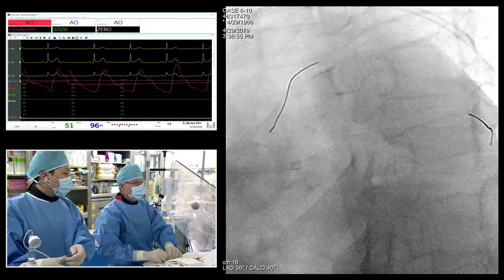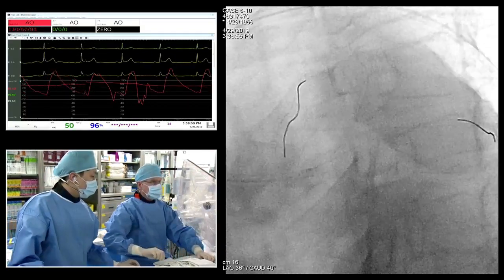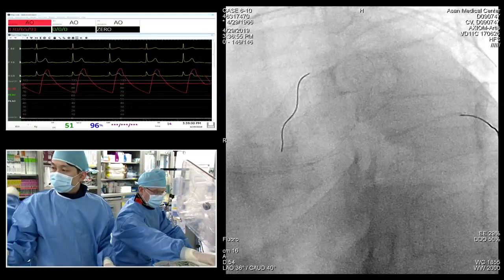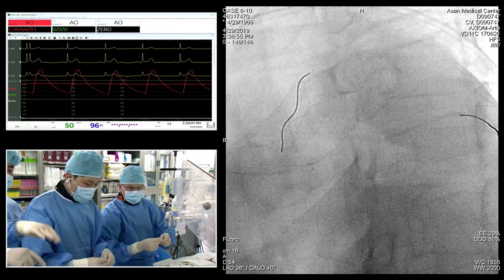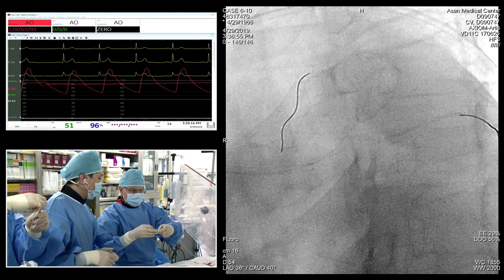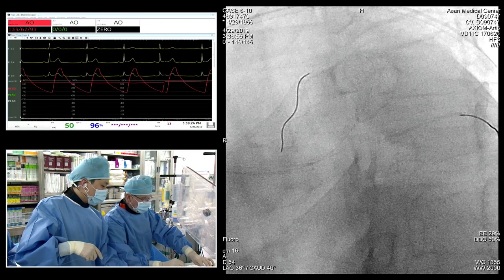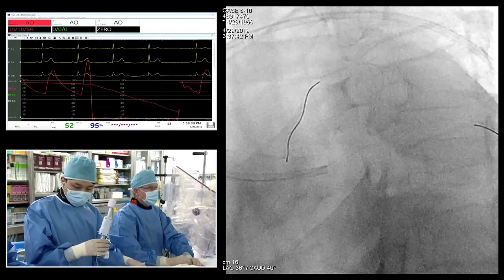Can we take a 3.5 stent? We decided to put a Sierra. 3.5, we're going to post dilate to 4 approximately, maybe even 4.5. But for the LAD, I think 3.5 is an appropriate size. And if we have to do stenting of the circumflex, which I doubt, we will do T-stenting. It's very favorable for T-stenting. But I really think 90% we should be able not to stent the circumflex. Okay, this is a 3.5 Sierra.